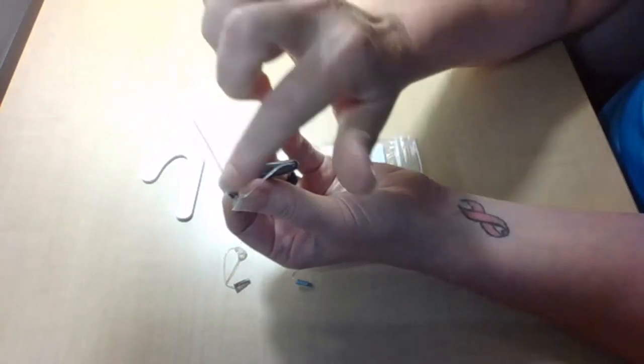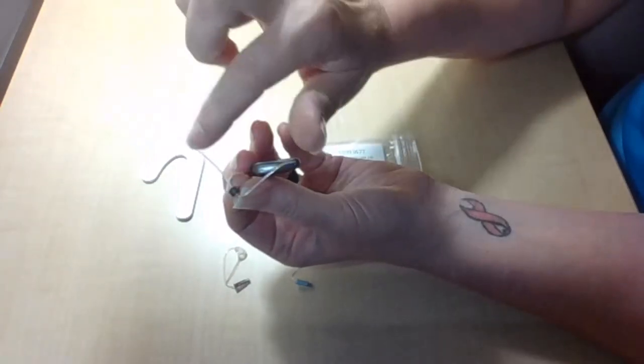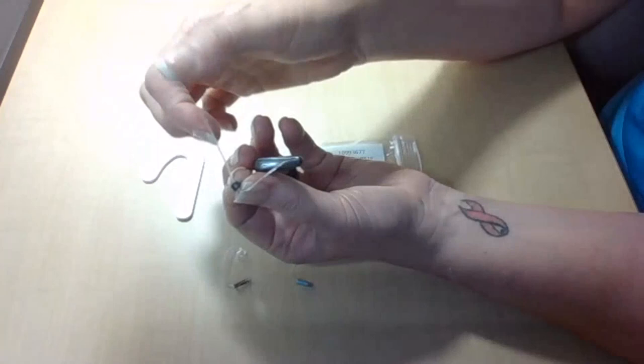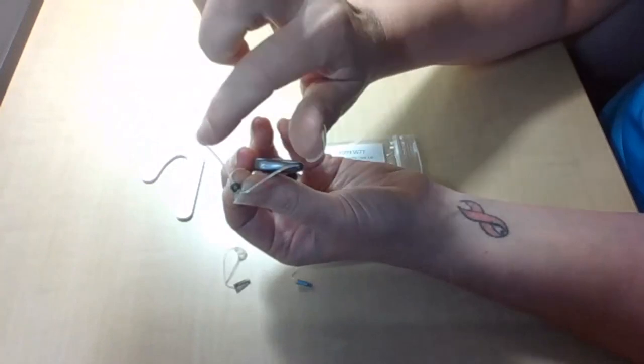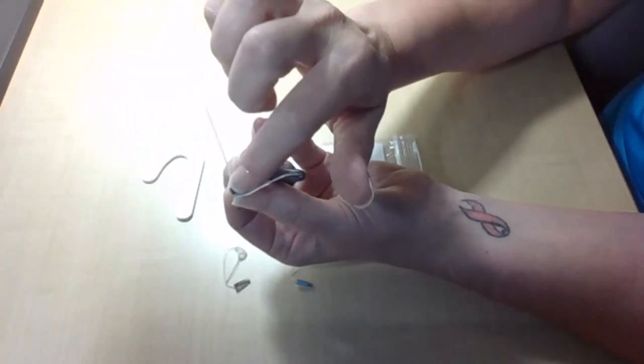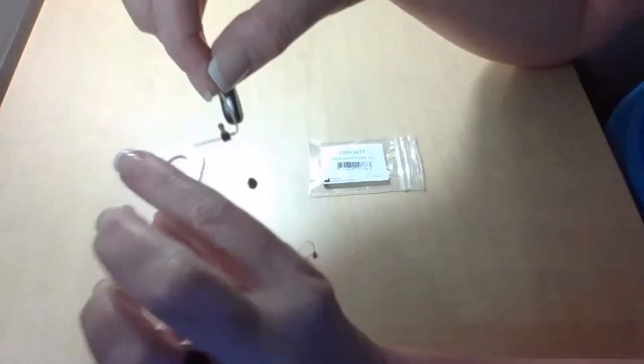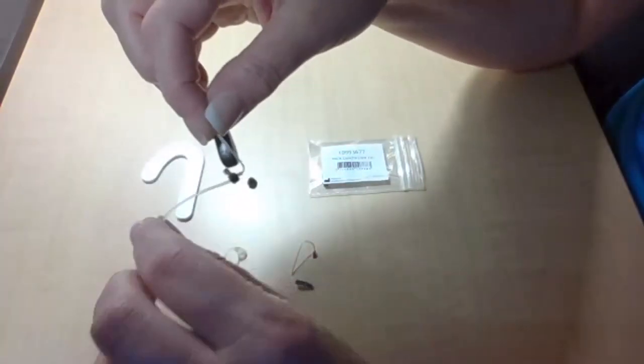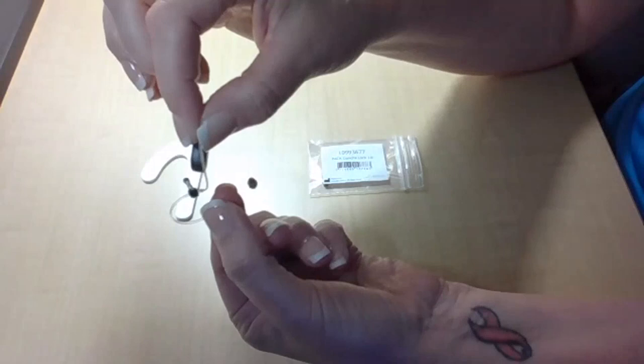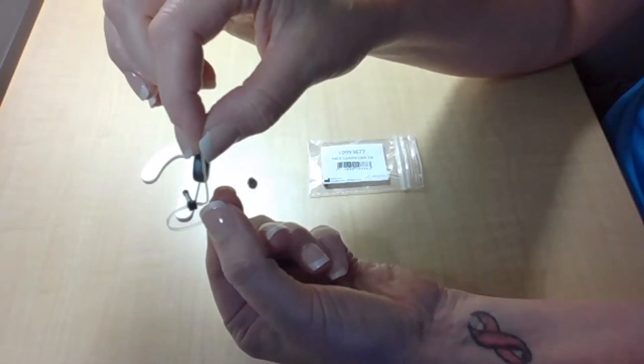Again, when you look at how that ConchaLock looks when you pop it on there, it does come straight across from where that receiver wire attaches to the base of the receiver. When it's in the patient's ear, that's then going to be able to loop around, like so, and hold that into the ear like a kickstand.